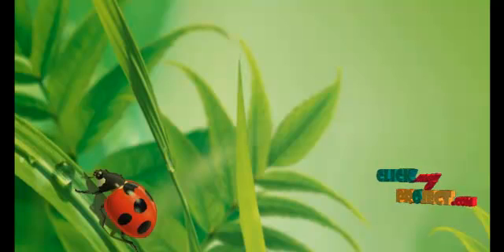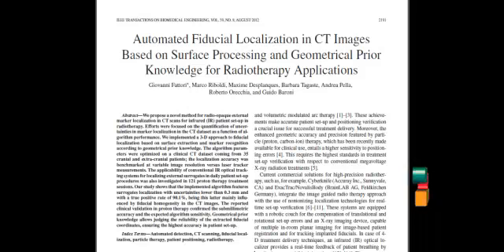Let me discuss the process of automated fiducial localization in CT images based on surface processing and geometric prior knowledge for radiotherapy applications. Initially, the scanned images from the patients were first pre-processed in order to remove the noises from them. For pre-processing, we are using a median filter.